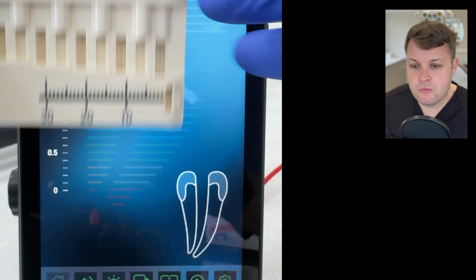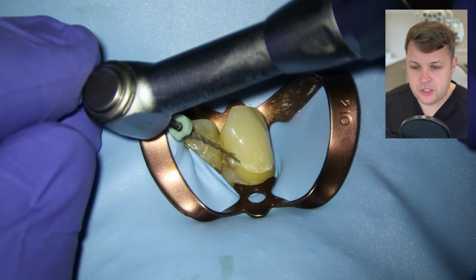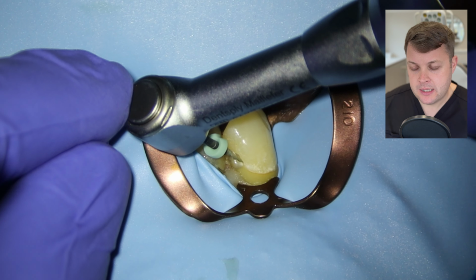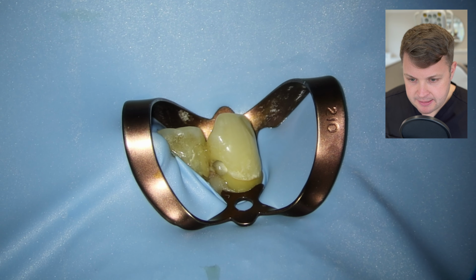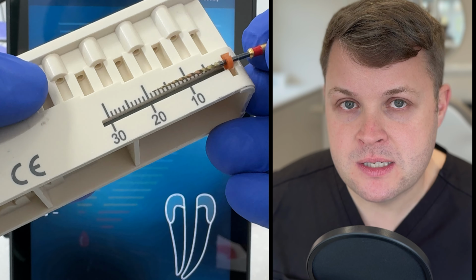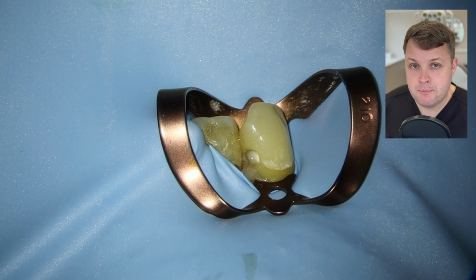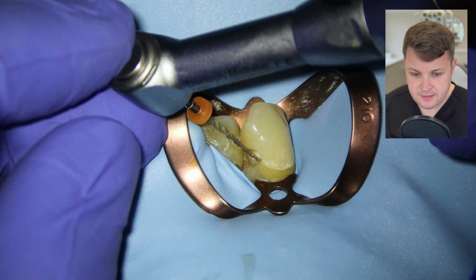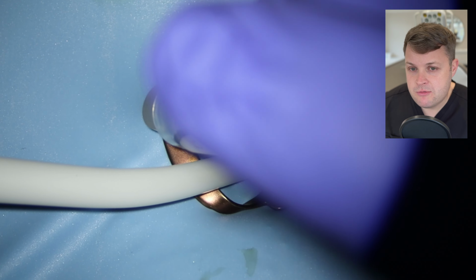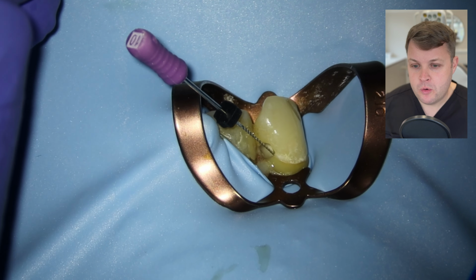So I'm going to use some rotary files here at about 18.5 millimeters. And what this is going to do is open up the access cavity ever so slightly, and also open up the canal slightly. And I notice again this size 20 is struggling slightly, and I'm very, very deeply concerned about fracturing these files, especially because they have to go around quite a tight bend. But nevertheless, I use a size 25 high flex. These rotary files work pretty good. So I'm concerned about file fracture, but I'm not overly concerned.